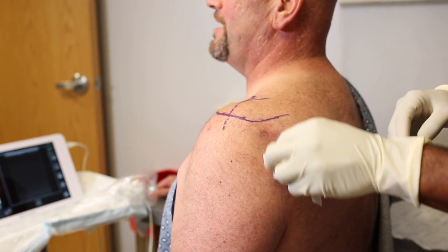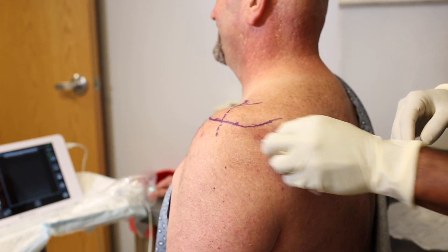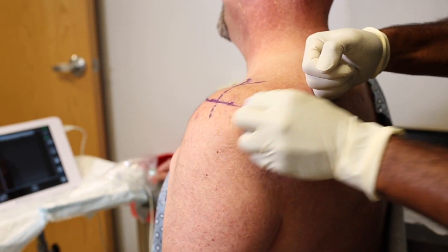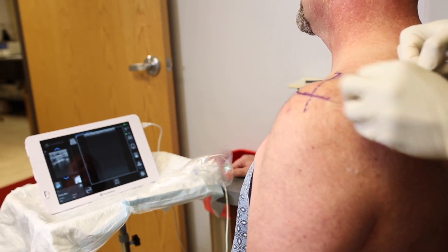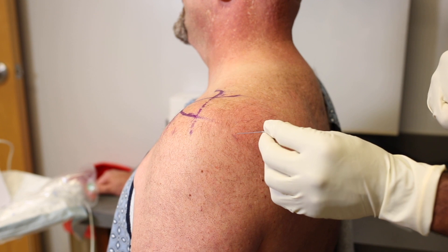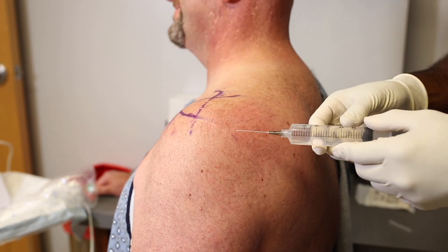There are several tricks for using ultrasound to help with in-office arthroscopy. The overriding concept is to match what we do in surgery so we can get the same visualization. Here we have the patient in the beach chair position. I typically operate in the lateral decubitus, but we can easily convert to beach chair position when we use these needle arthroscopes in the office.